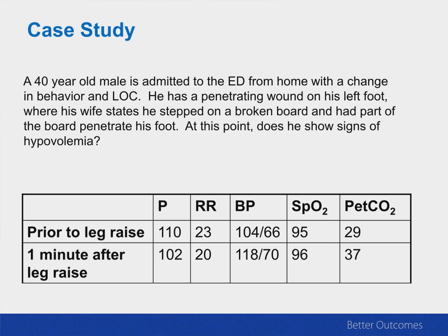So this is now a patient who you'd suspect is having sepsis. So what we do is we take a look at him, and right away he's tachycardic, he's tachypneic, so he's got 2 signs of SIRS. Clearly we're concerned about him. But I also want to check and see, is he volume depleted at this point? So we do a passive leg raise, and 1 minute after the leg raise, and this is the beauty of a capnogram, it tells you literally immediately what's going on.